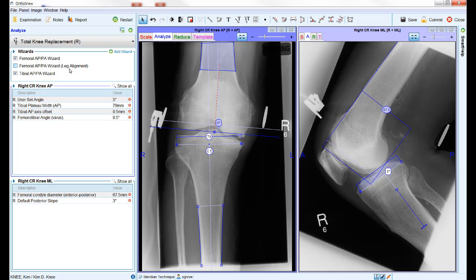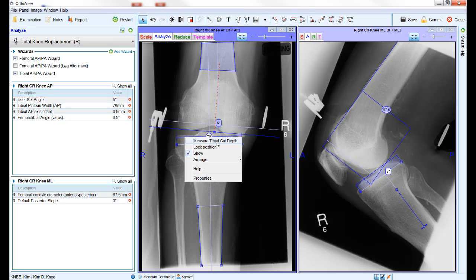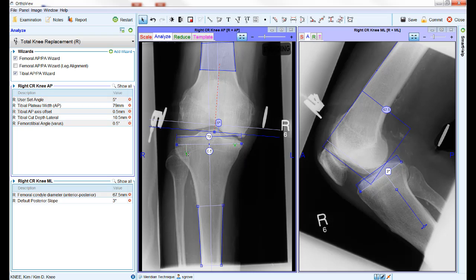In the AP view, both wizards have an option for displaying medial and lateral cut depths. To use this option, right click on the wizard and the pop-up menu will display the option for femoral or tibial cut depths as applicable. Measurements start at the pale blue line of the wizard, which represents the cut line for the implant, and the opposite end can then be dragged to the top of the bony area to measure the cut depth on each side. The values for cut depths are displayed in the results panel on the left hand side of the screen, along with all of the measurements generated by the wizards.